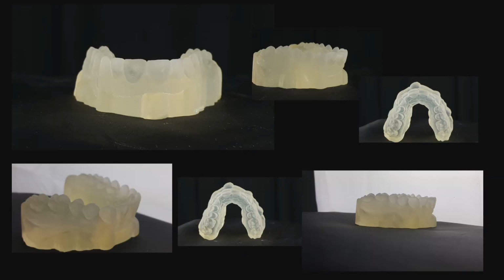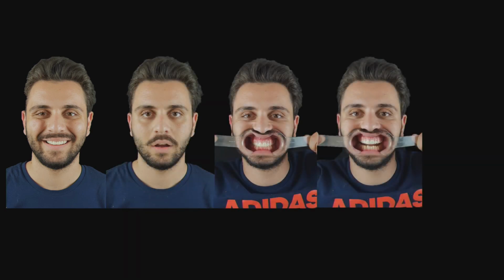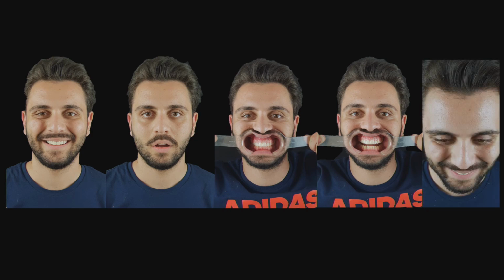And after printing the STL file, this is the printed model. We take an impression on this printed model, and we put bis-acrylic, and you can see the result in the mouth of the patient. We can do again all the steps, and you see the new mock-up for the patient and the new design. Now Dr. Iliev will be on the stage to answer all your questions.